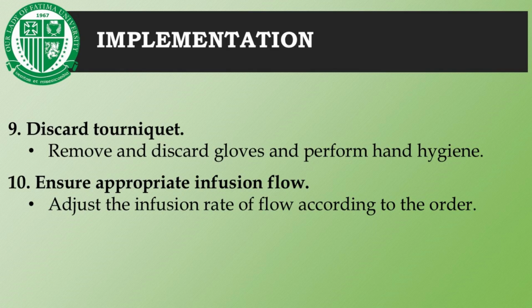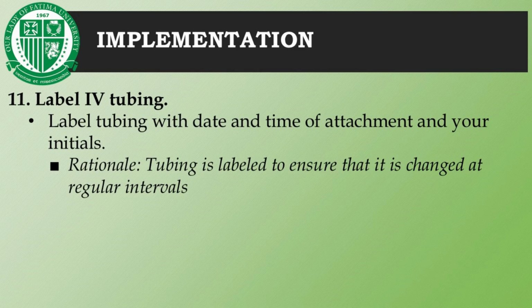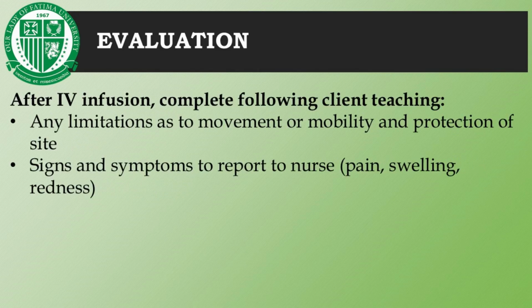The nurse should also ensure appropriate infusion flow by adjusting the infusion rate of flow according to the doctor's order. And lastly, do not forget to label the IV tubing. Again, label the tubing with the date and time of attachment and your initials to ensure that it is changed at regular intervals. For the evaluation, complete the following client teaching after IV infusion.